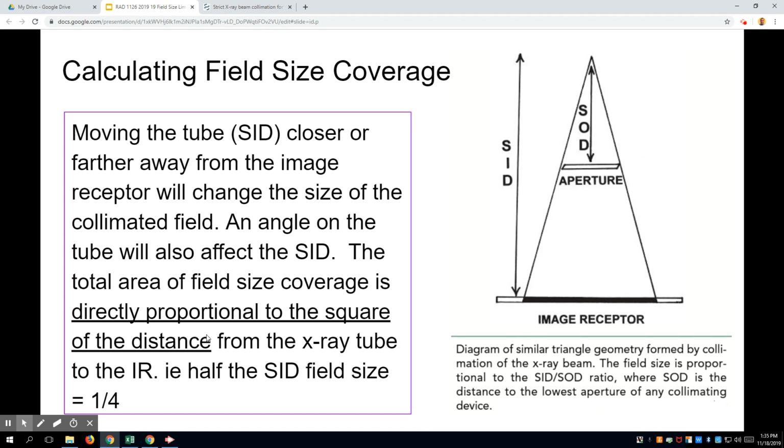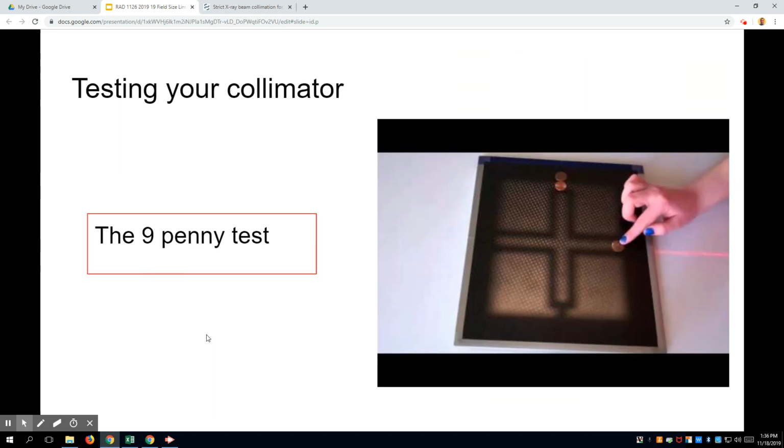And the reason why earlier, at the very beginning, we talked about never having it larger than the image receptor itself. I have seen students have a really big, let's say football-sized patient. They put a 14-17 in lengthwise, which maybe they shouldn't have put in lengthwise. Maybe they should have put it in crosswise to begin with. And then they have the light field beyond the borders. So imagine there's no PBL in this case that fixes it for you. They're actually beyond the image receptor because the light field still is not even beyond the patient's shoulders because they're so barrel chested, for example. It's a skill.